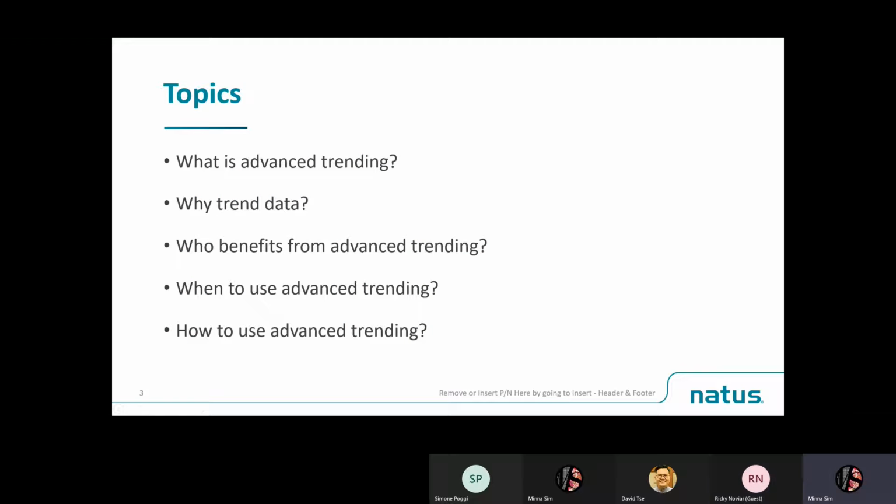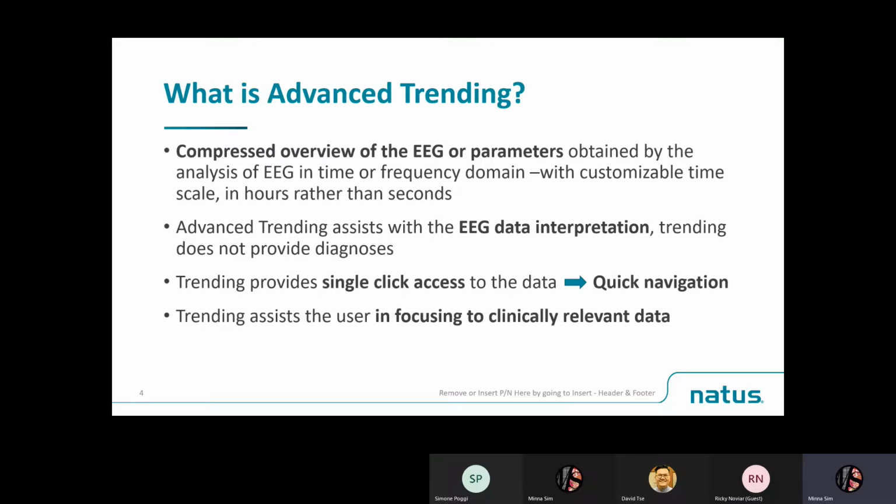So we'll be discussing a few things: what is advanced trending, why do we want to trend data, who benefits from this feature, and when and how to use it. We will go into details one by one.